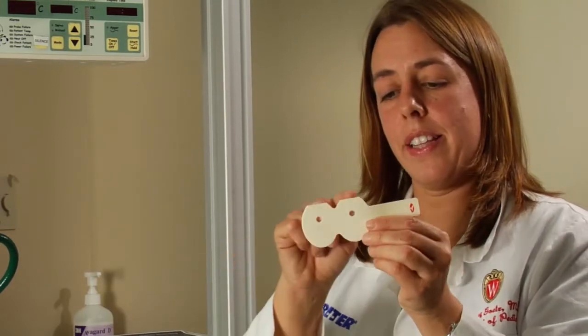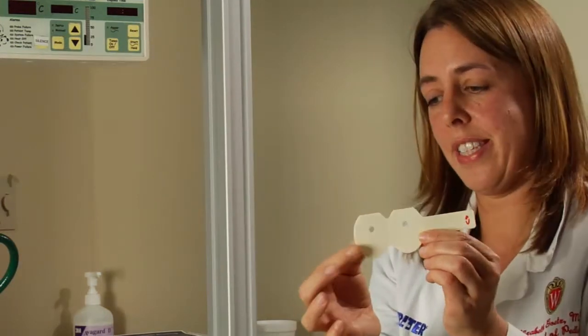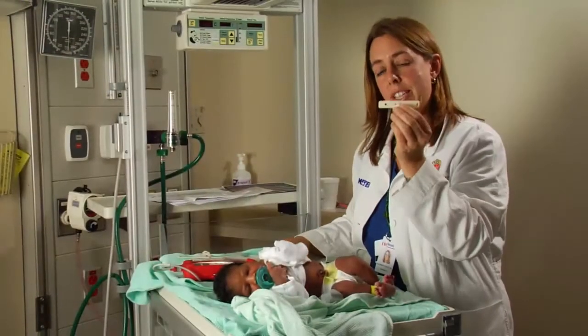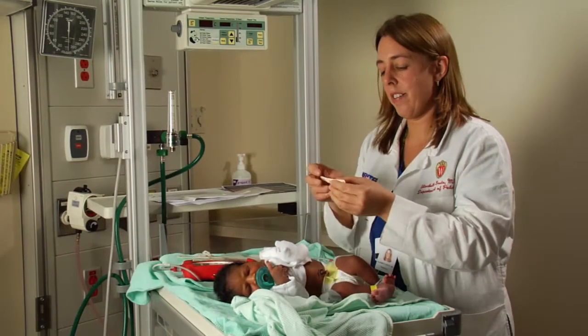Another type is actually an adhesive. The adhesive goes around the baby's hand and also adheres the probes to the baby's hand. And the third type has a clear sticker on the top part that comes down over the probes so that they're not actually touching the baby's skin. So I'll demonstrate with this probe cover, which is the most commonly used one, just a simple band.